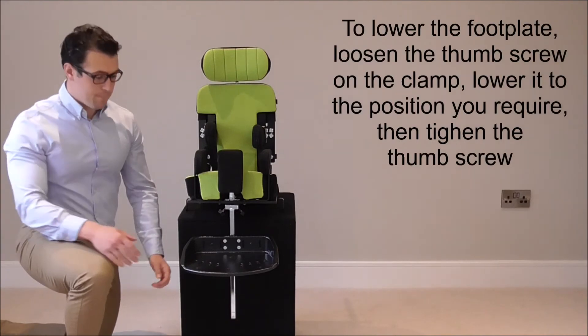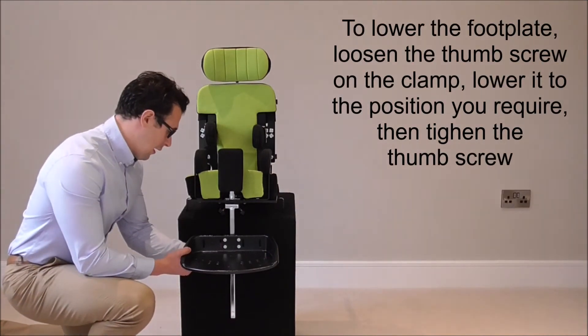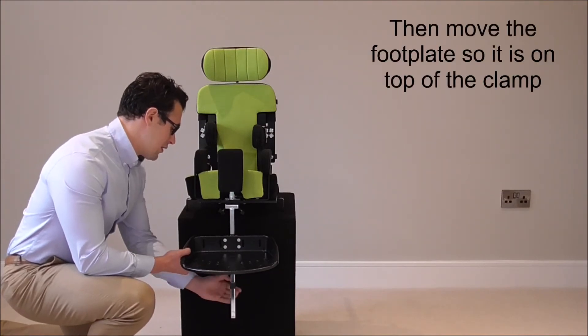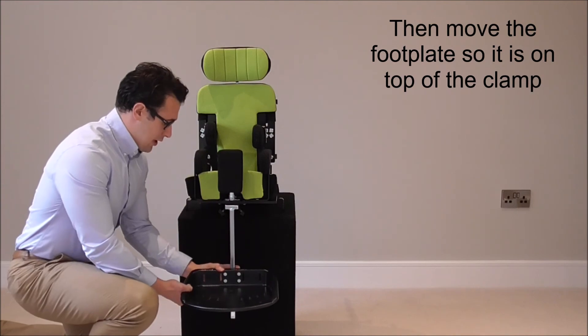To lower the foot plate, loosen the hand wheel on the clamp behind, lower it down to the position you require, tighten it up to make sure it's secure, then slide the footrest down.